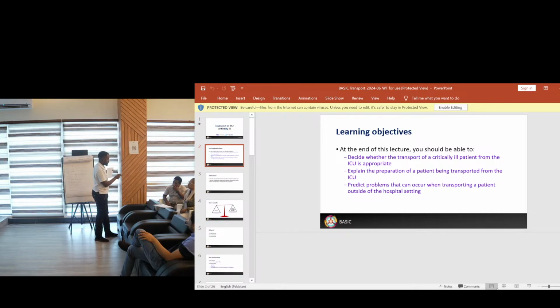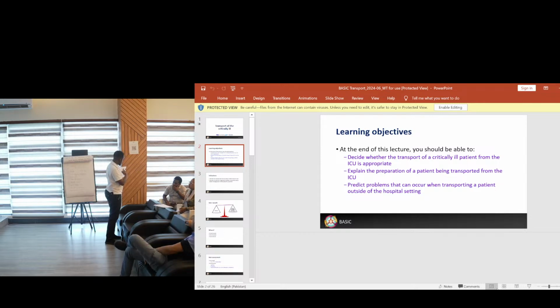If you're using an oxygen container, the patient is on a flow meter, maybe nasal prongs at 4 liters per minute. Your 4 liters per minute will be the oxygen consumption. So you take 2000 psi times the cylinder factor. The cylinder factor for E is 0.28, divided by 4 liters per minute. You get your minutes. What if they're on a ventilator at 50%?